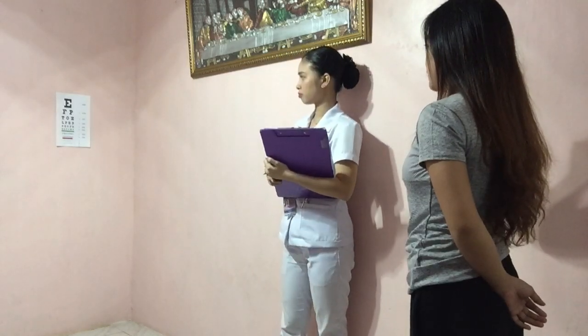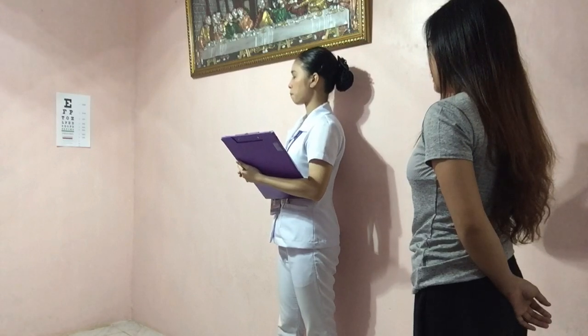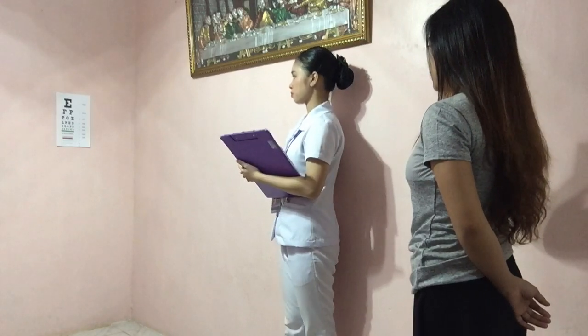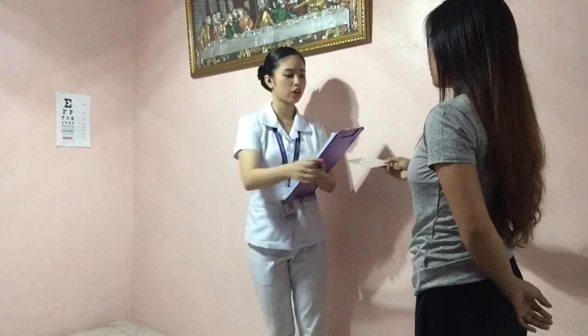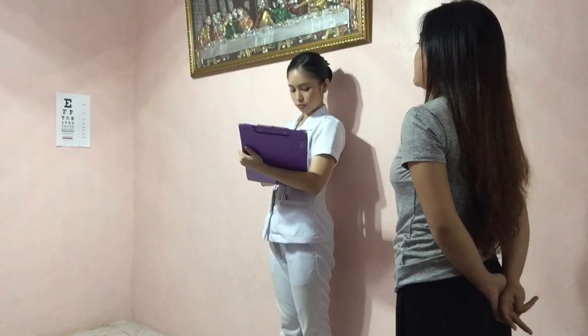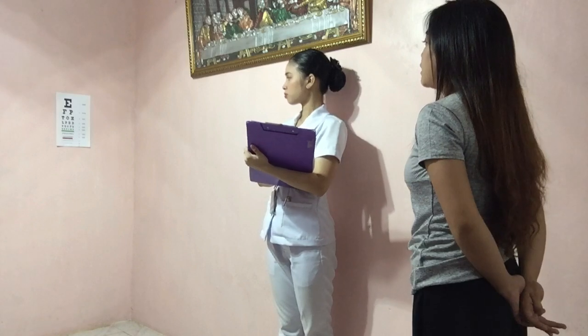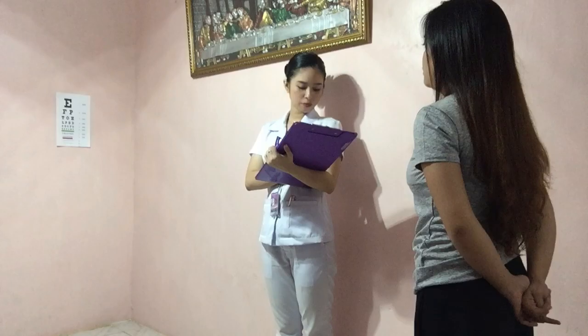E, F, P, T, O, Z, L, P, E, D, P, E, C, F, D, E, D, F, C, Z, P, F, E, L, O, P, Z, D, E, F, P, O, T, E, C. Okay, Althea, can you uncover both eyes now, then read the letters? Okay, that's great. Thank you for that.